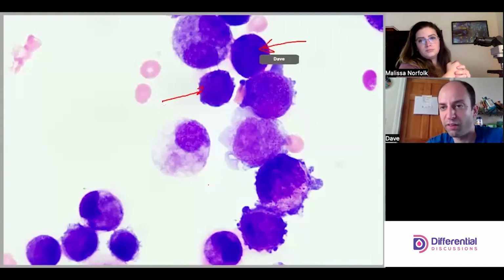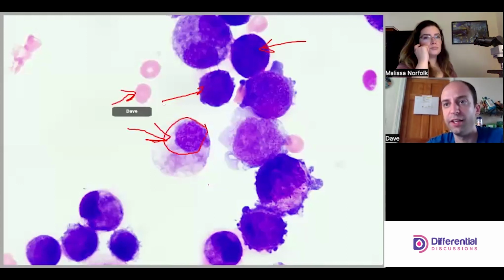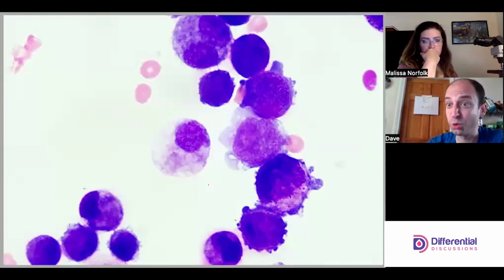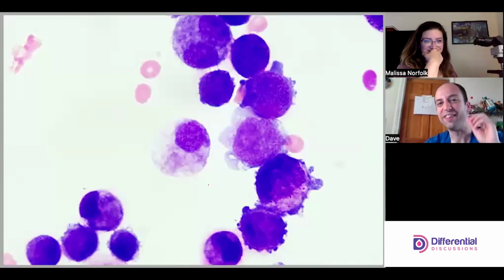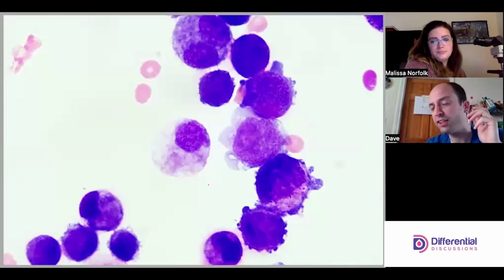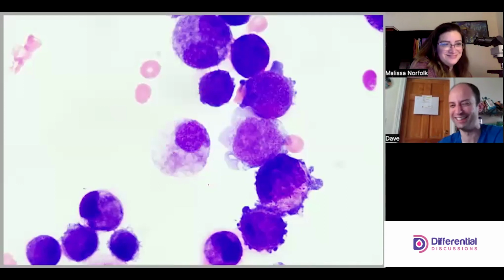Okay, so now let's rewind. I have a cell right next to it. I can see the cytoplasm clearly. I can see the nucleus definition clearly. I can see how red cells are staining. This stain is behaving exactly as it's supposed to. If you make another slide on this, that's cool to have extra slides because it's wonderful to teach. But this will not change. You can't make this go away, right? If I could make cancer go away by making more slides, I would make lots of slides, right?